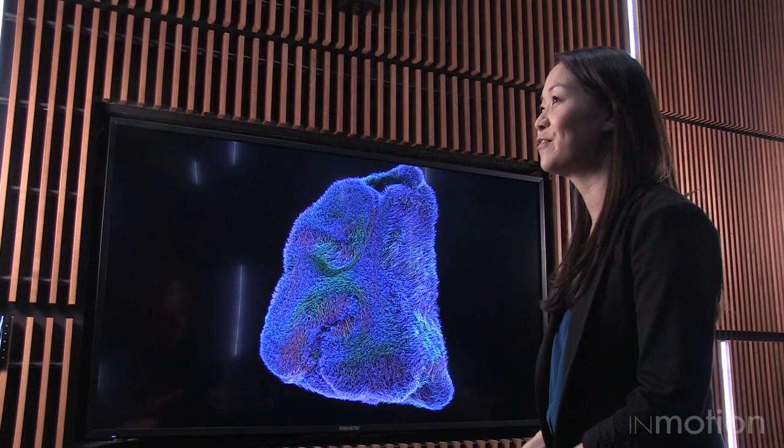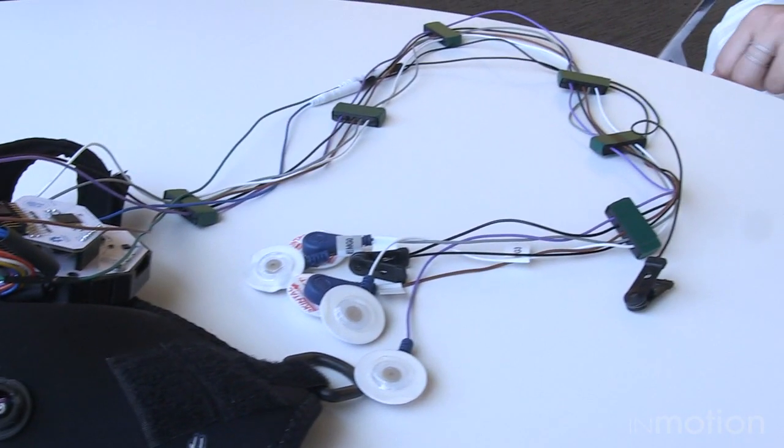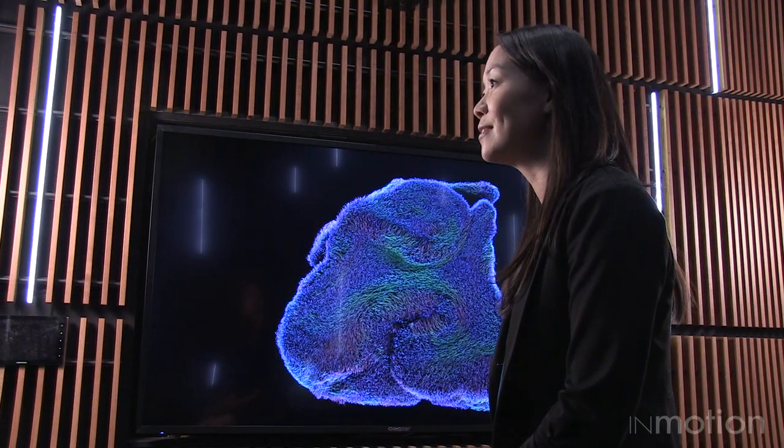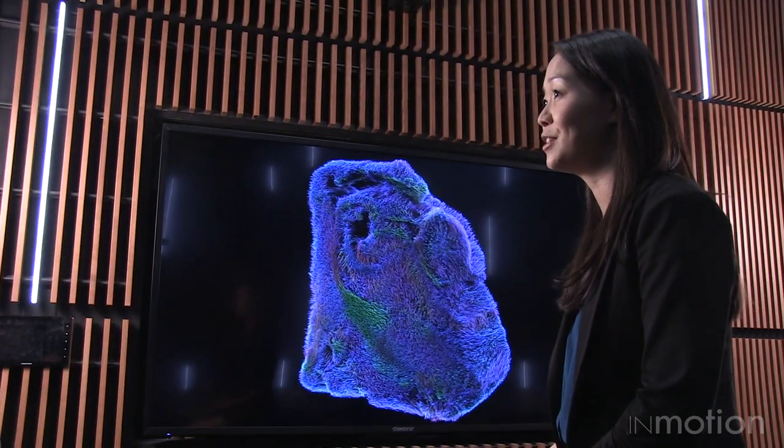We really tried to go for a low-cost system. And for most brain-computer interfaces, the biggest cost is in the brain reading equipment. A whole system usually costs anywhere from $10,000 to $30,000. And this makes it really prohibitive for people to be able to access it, so they have to come to a center to use it.